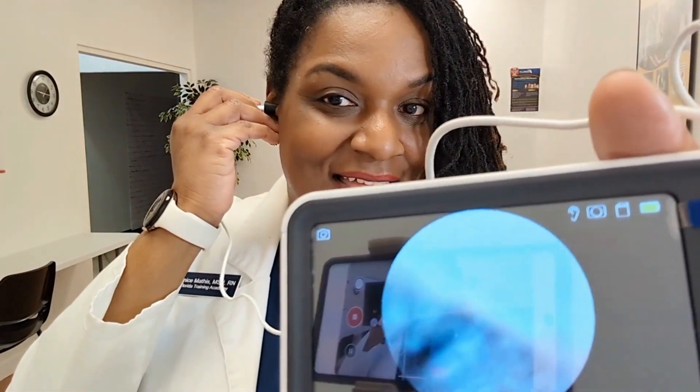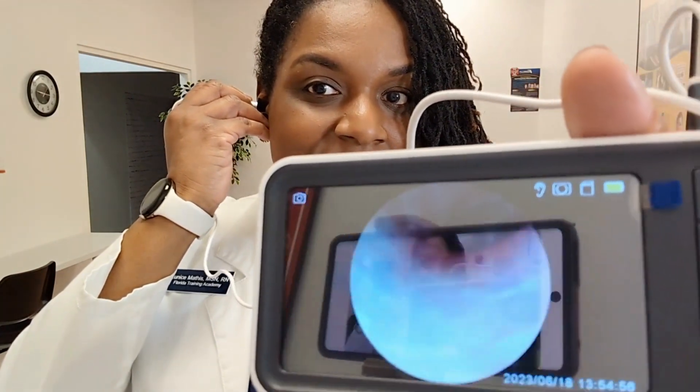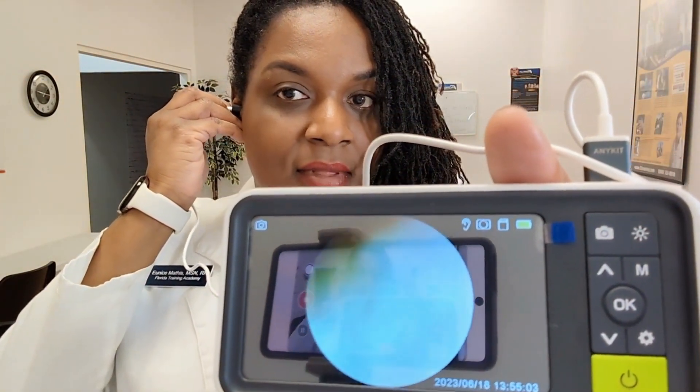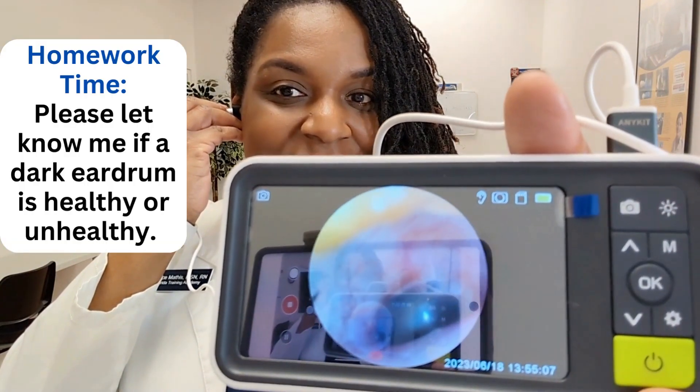If you're squeamish, maybe you want to turn away, but I'm actually going to show you what the inside of my ear looks like. All right, let's go. So there's some hair, there's some wax, and there's my eardrum, everybody.